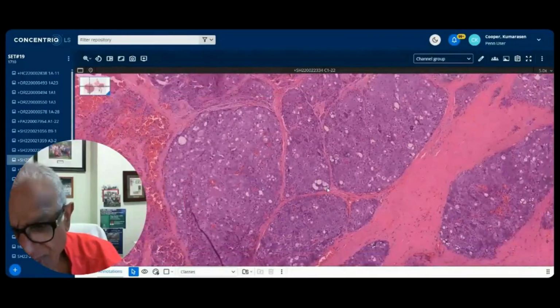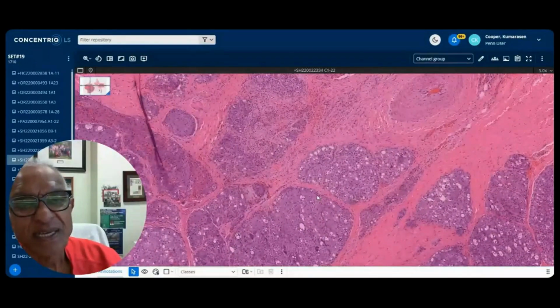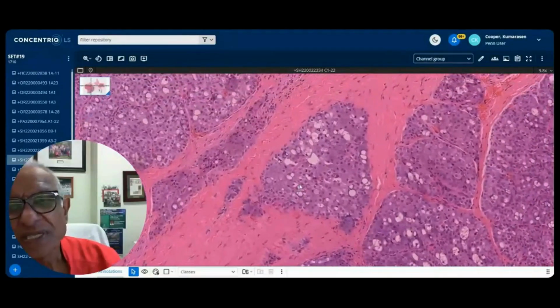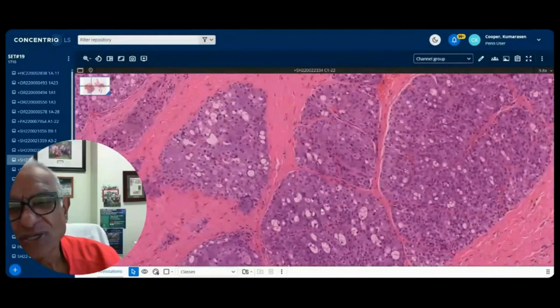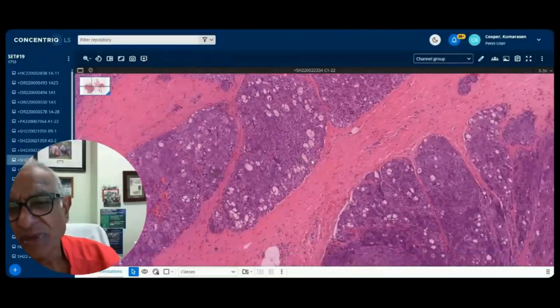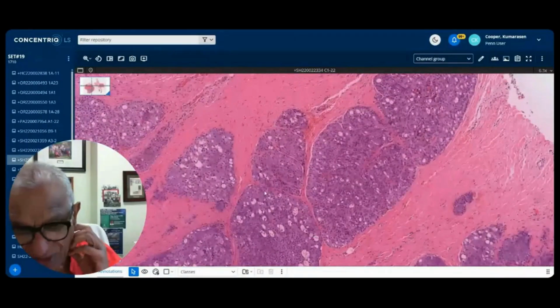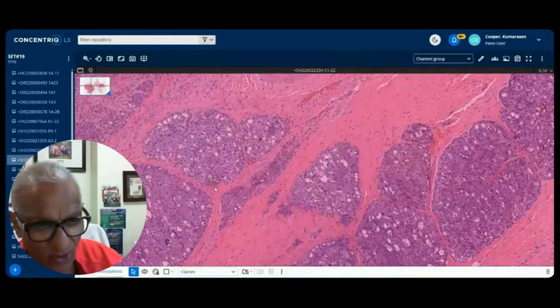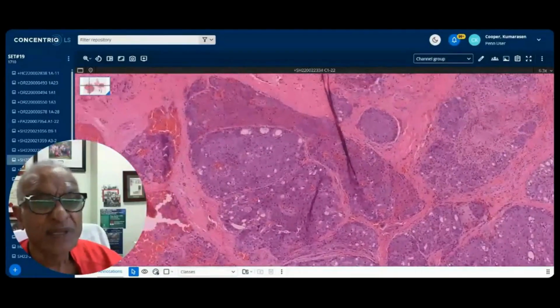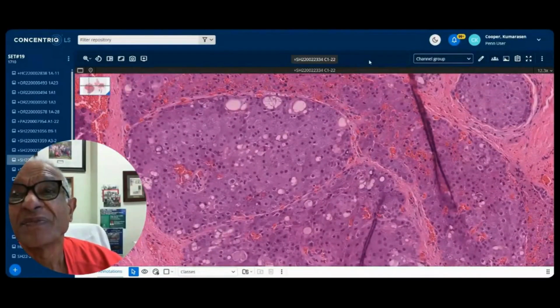Remember, we're looking at a parotid gland mass. This was submitted as a biopsy, and I'm not so sure why they cut through this. Our surgeons don't like biopsying parotid gland tumors. They typically do an FNA, and they get good guidance from our FNA cytopathology colleagues, who would give a morphological diagnosis and allude to whether it's benign or low grade, or a differential diagnosis, and then surgeons proceed from there. So very, very rarely do they biopsy it. So here we go. Let's see what people are thinking.